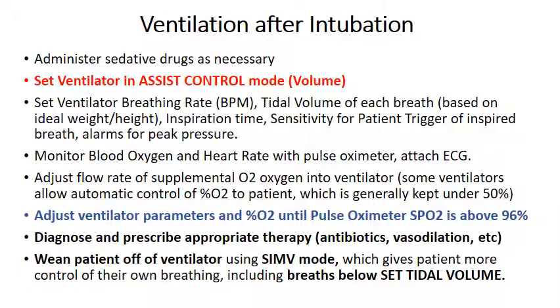Let's assume that the airway has been cleared and the patient is still not able to breathe on their own. If they can't inhale or exhale, supplemental oxygen as delivered through a nasal cannula is not going to do any good. This is a case where intubation will be necessary and a mechanical ventilator will have to do the breathing for the patient. This is perhaps the most complicated piece of medical equipment that any technician will deal with, because to understand ventilators, you have to understand thermodynamics and fluid dynamics as well. The physics is quite complicated, plus the physiology of how you set it up for different lung compliance conditions that are due to different diseases is very specialized knowledge needed by a respiratory therapist.